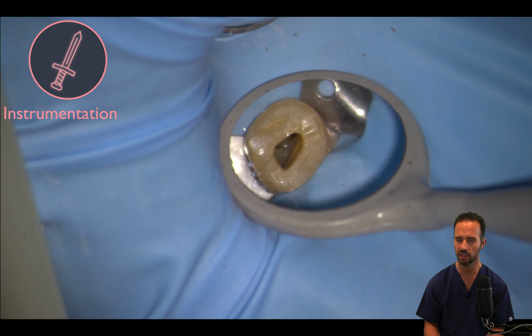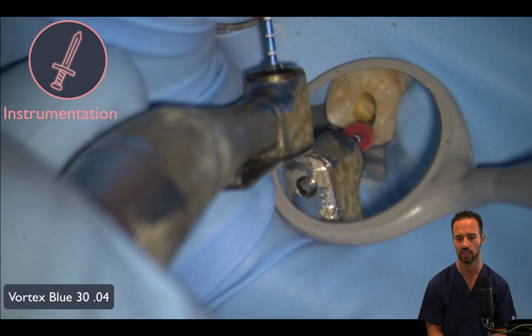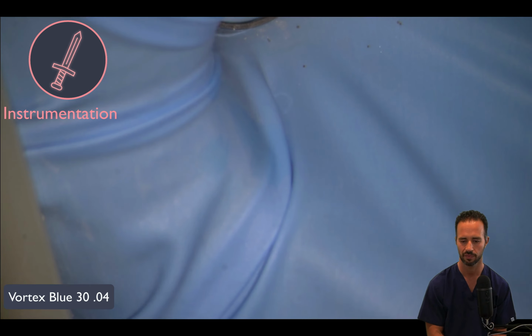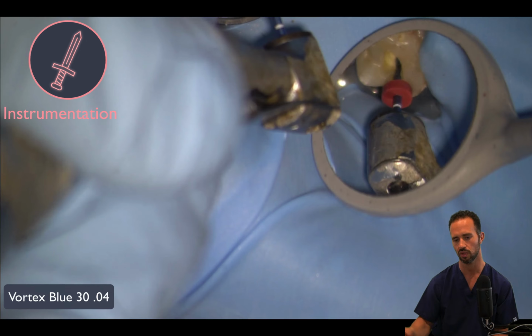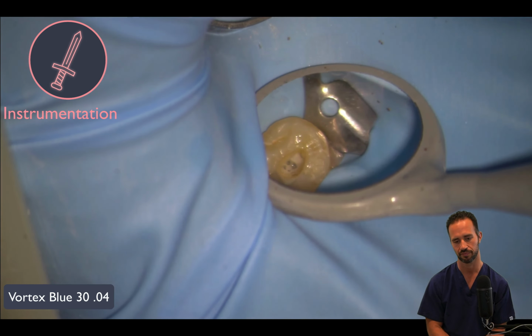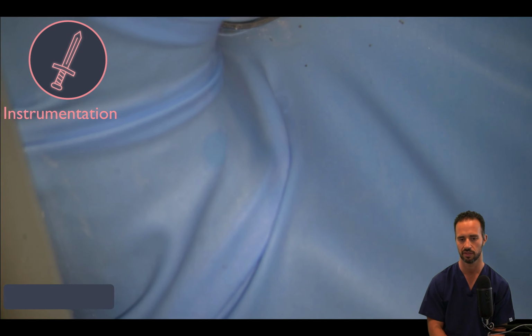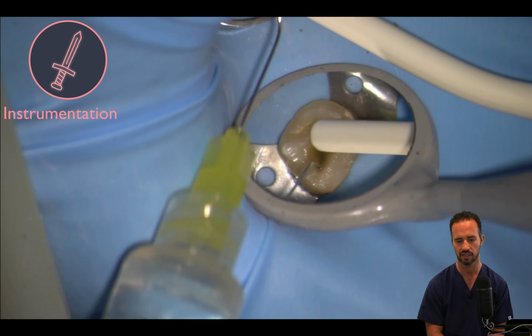Very good. And you can tell it's already taking shape here. This is kind of your textbook access preparation and your textbook canal locations. So here we have our 30/04 Vortex Blue rotary file in the mesial buccal. Our assistant wipes. We take our RC Prep and load it on the tip as usual, and then we go into our next canal, in this case the distal buccal, to 19 millimeters. And now into our palatal canal, again at 19 millimeters. A lot of sodium hypochlorite throughout the case.